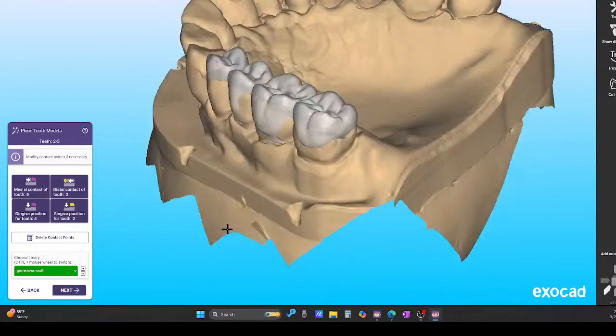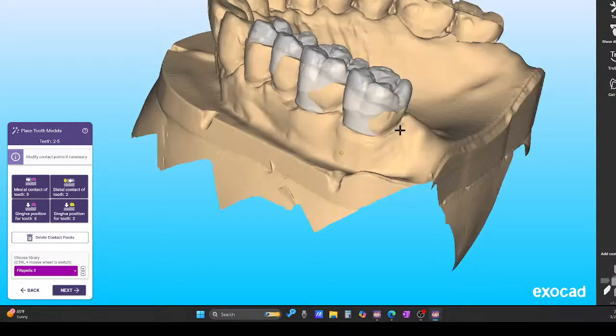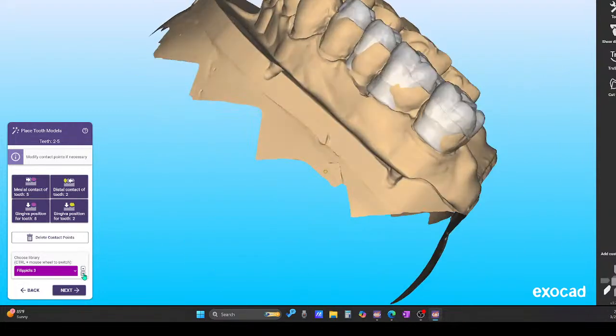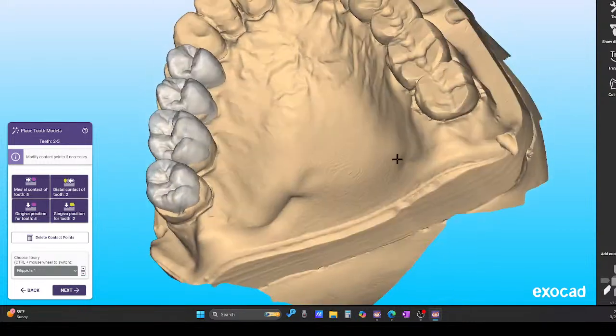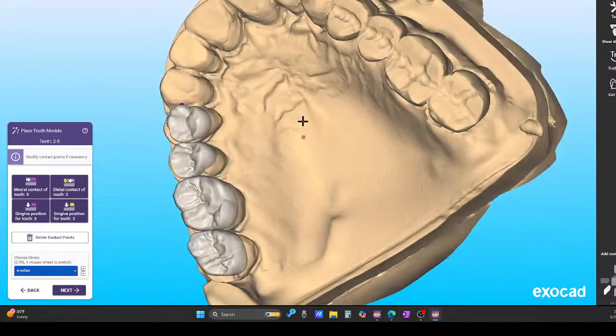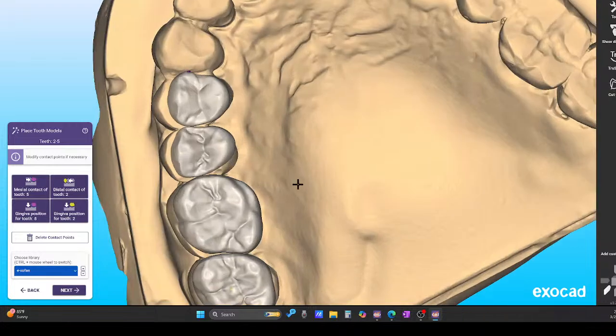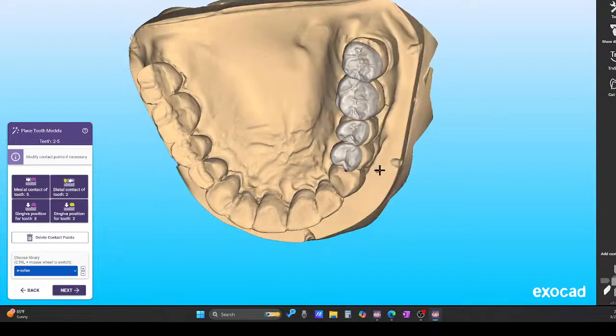I like this one, but it goes too far to the cervical. I like this one, generic. I don't like those that cover the entire tooth on the facial side. I prefer to keep it at the top. So excellent. Let me see. This has too much anatomy. Let's see that.